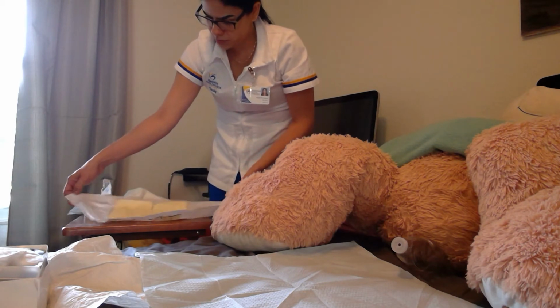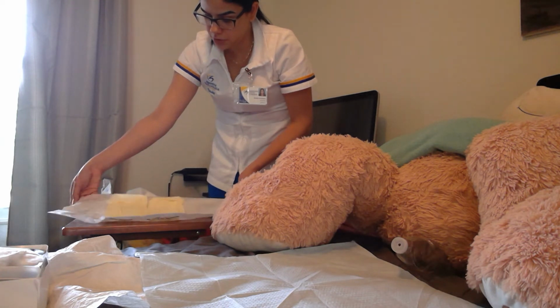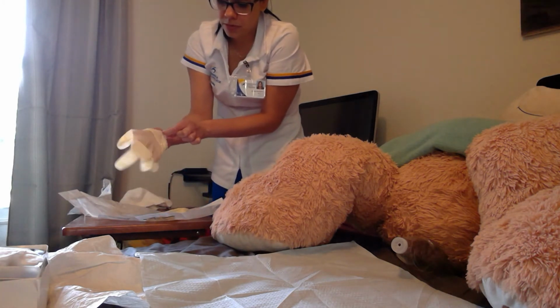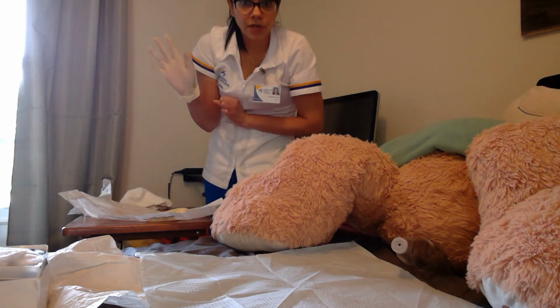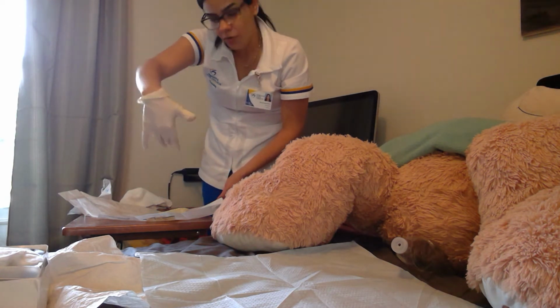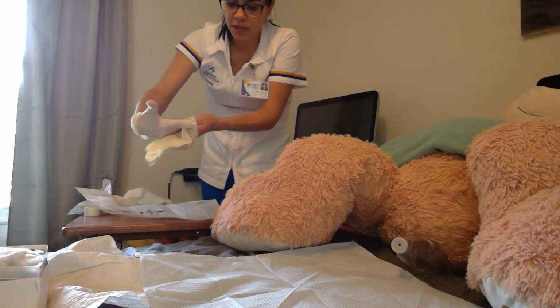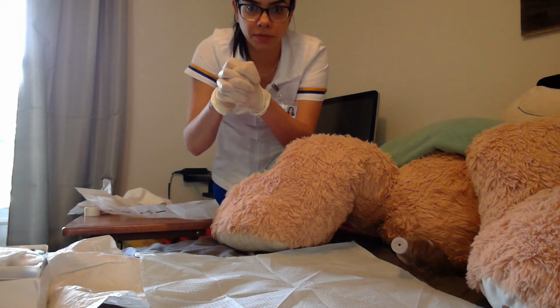I'm gonna do my right glove, my right hand first. I'm gonna touch the inner portion of my glove. Okay, and the first glove is in, and then I'm gonna take with this hand the outer part of the second one like this, and then I'm gonna put my hand in, making sure, and I have my gloves on.